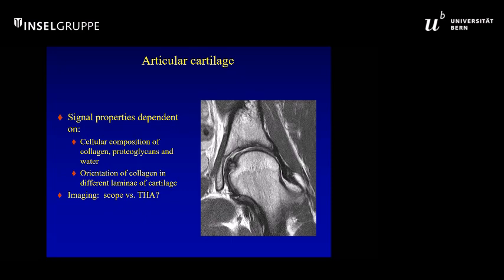So we all know about looking at cartilage on MR. It's important to remember that it is a normal grayscale stratification that reflects the orientation of the collagen in the extracellular network, with lower signal intensity as we get closer to the tide mark. We can use MR as a means by which to determine suitability of our surgical approach for patients. We do this at HSS, determining if someone is really more suited for an arthroplasty compared to a preservation technique.